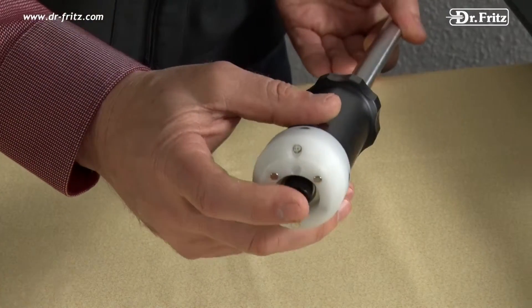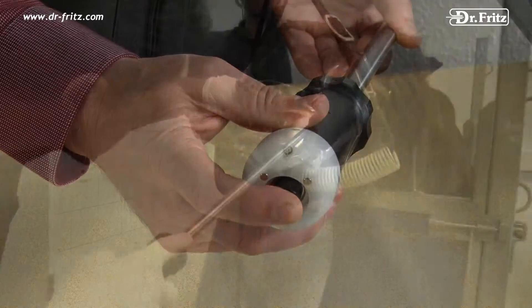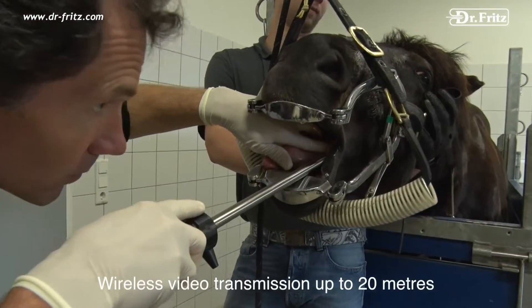By pressing the button you turn on the endoscope. The integrated sender unit transmits the video data to any number of receivers in a range of 10 to 25 meters.